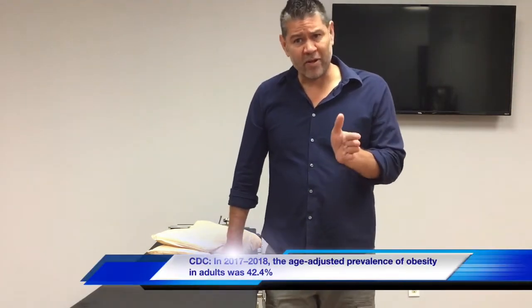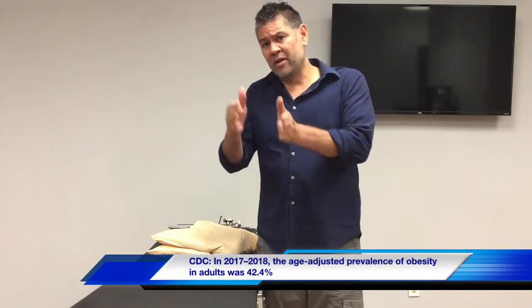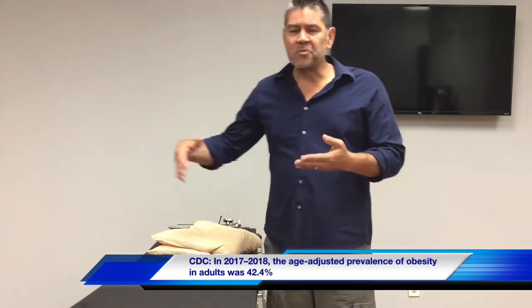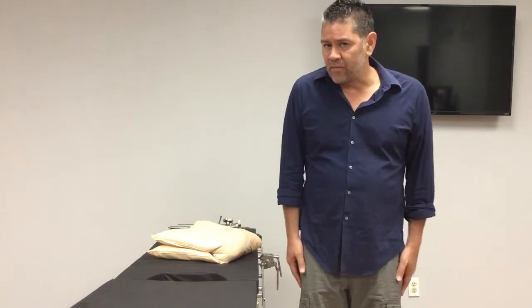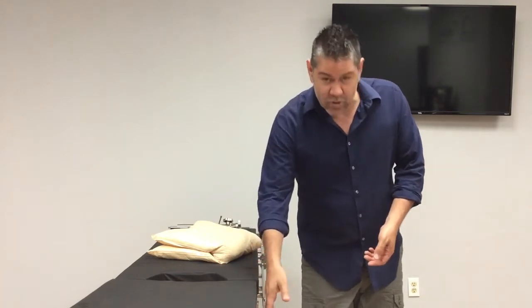Currently in the US, about 40% of the adult patient population is considered obese, with BMIs greater than 30. And when they go up from 30 to 40 to 50 and so on, it creates a spatial difference on how we apply those patients on our tables. Some of these accessories can actually get close to the patient and indent the skin or create tissue, vascular, nerve injuries. Also, even for moderate patients like myself, who's moderately obese probably in some regard, there's a lot of procedures that require us to tuck one or both arms. This will also add to the circumference of the patient, especially in relation to the surgical rail structure.